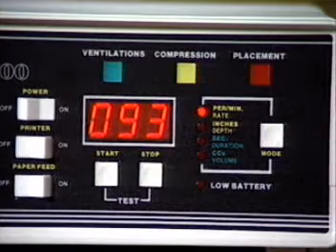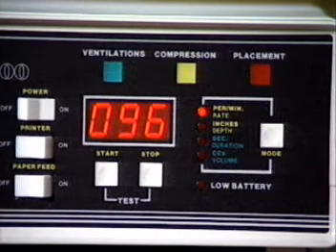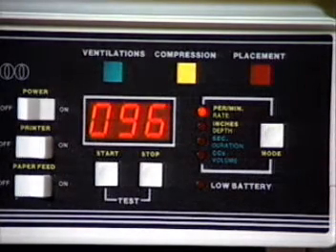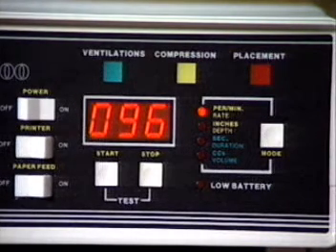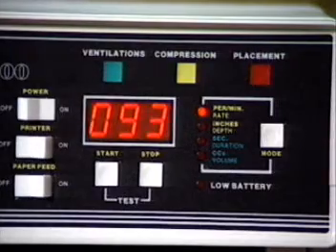This figure is in terms of compressions per minute and is a running average of the last 5 compressions performed. As the trainee varies the compression rate, the average will change to show the current rate of compressions per minute. As each compression is applied, the yellow indicator light will come on when proper depth is achieved. The yellow light will turn back off if the compressions are too deep.